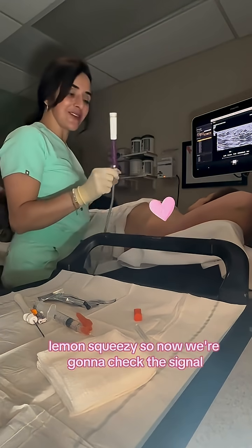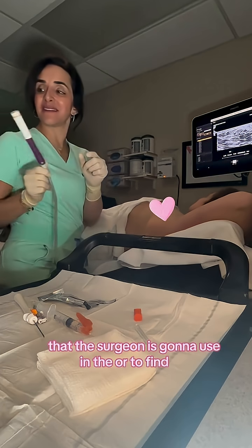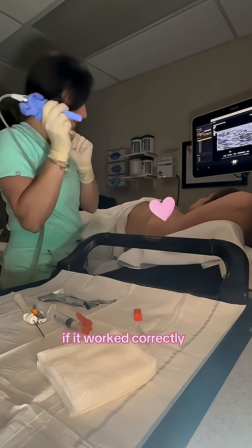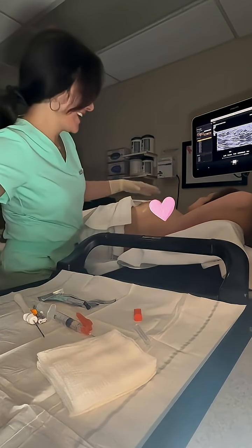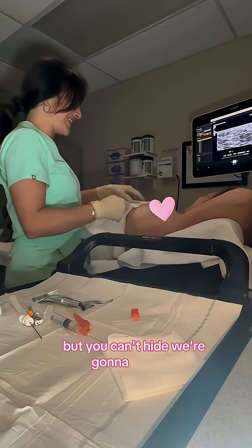Now we're going to check the signal. This is a radio frequency tag and this is a radio frequency detector that the surgeon is going to use in the OR to find the mass that needs to be removed. If it worked correctly, we should have some signal. There she is. I always say you can run, but you can't hide — we're going to find you.